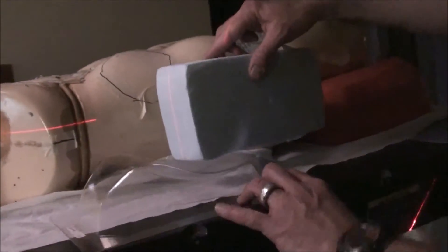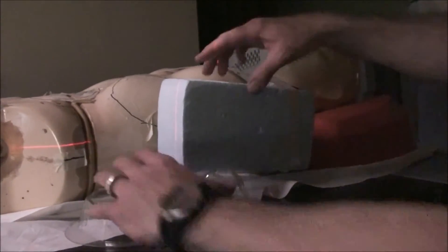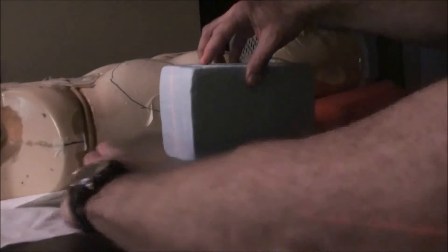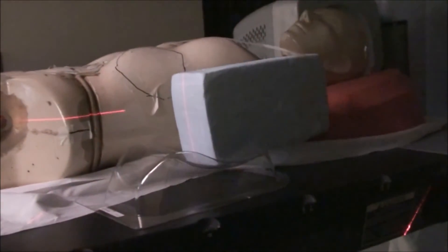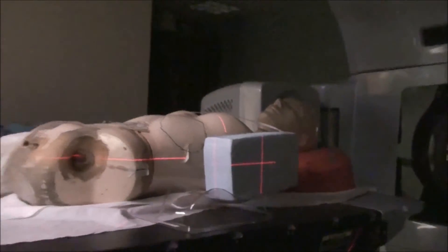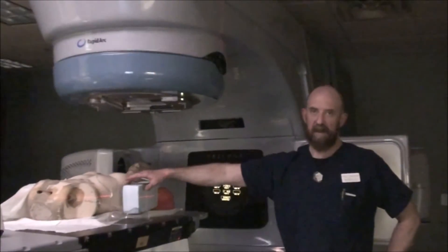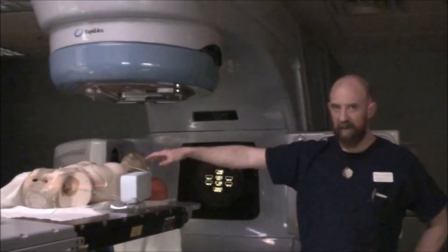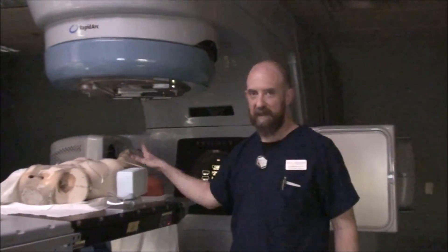An individual picture of something special is a fourth picture you can often take. In this particular case, take a fourth picture of exactly how that elbow was resting on the headrest itself. The elbow position can also differ depending on how far in and out you place it, so in order to be reproducible, take a picture and put it the same every time. After that, as per usual, any permanent marks — do them now. If not, protect these marks, educate your patient, and you're finished.